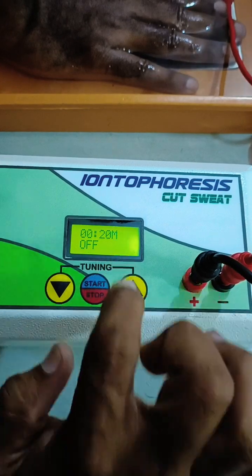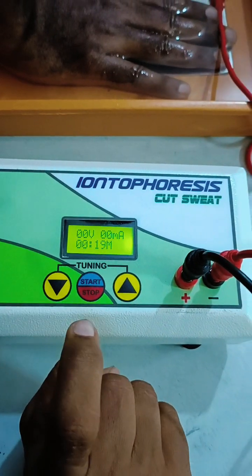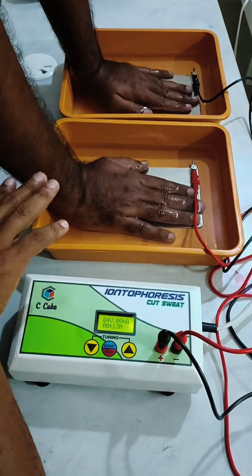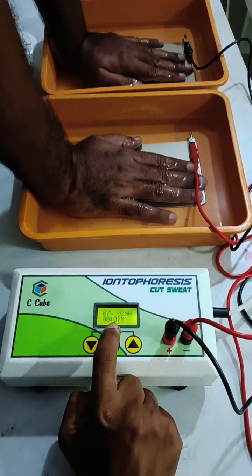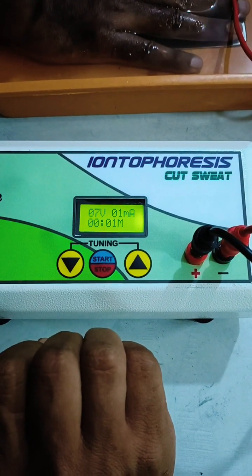The display shows minutes and seconds. The device is currently in off mode. Once you press start, place your hand in the tray within 5 to 8 seconds so that treatment can be delivered. You can see the decrementing timer — once it reaches zero, the treatment will switch off automatically.